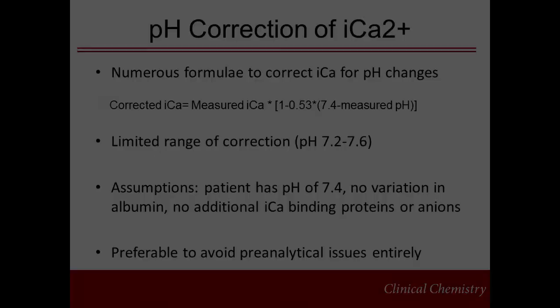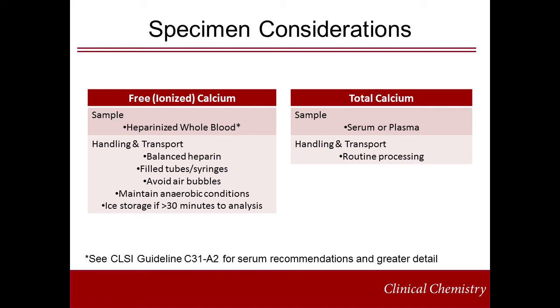In order to avoid pH changes during collection and transport and eliminate the need for correction, it is worth considering the specimen requirements for free calcium measurement. Heparinized whole blood is most commonly used for free calcium measurement. Whole blood samples should be collected in devices containing balanced heparin to avoid artificially lowering calcium concentrations due to chelation. Vacutainer tubes or syringes should be filled adequately to avoid dilutional effects of liquid heparin or excess calcium from balanced heparin. Air bubbles should also be avoided to minimize loss of CO2 and associated pH changes. Anaerobic conditions must be maintained to avoid pH changes which would affect the concentration of free calcium. Ice storage is appropriate for samples that will take longer than 30 minutes to analyze, where cooling the samples will minimize the effects of metabolic changes on pH.